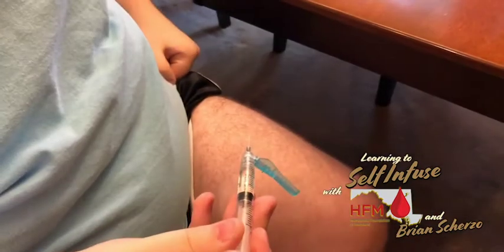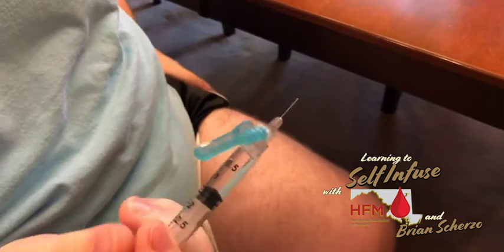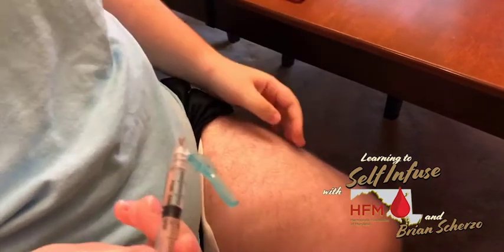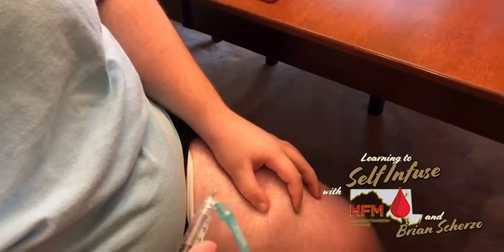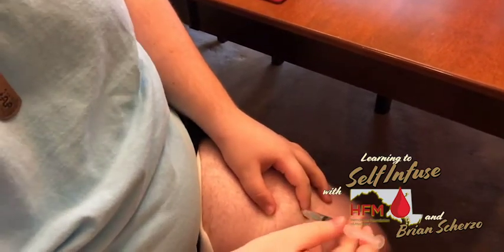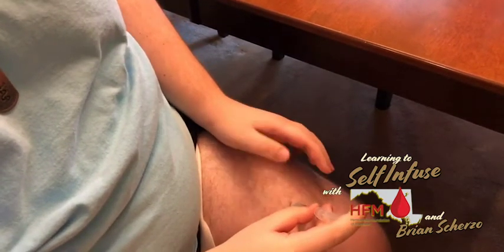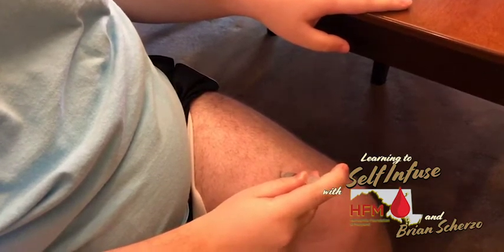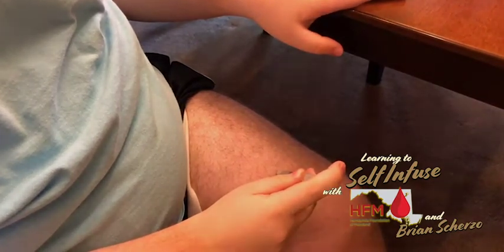We're ready to do the injection. Because this is a sub-Q injection, it's a little different than an IV. What I have to do is grab a tiny piece of skin — make sure I have a nice little pinch — then take a deep breath in and let it out, push it in a little bit, make sure it's not burning, and then push nice and slow. You don't have to go at a snail's pace, but make sure you keep a consistent pushing force when you're doing your infusion.